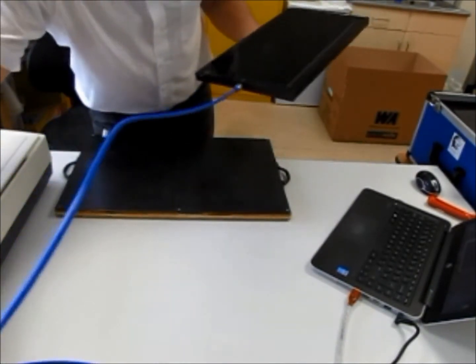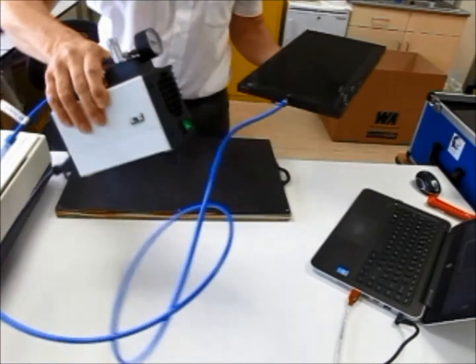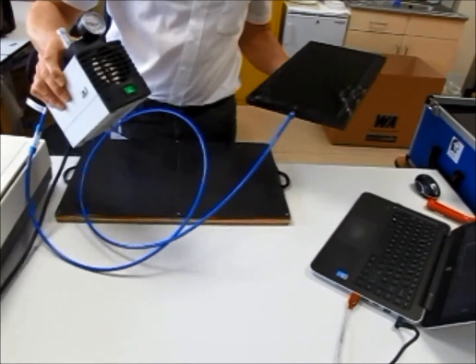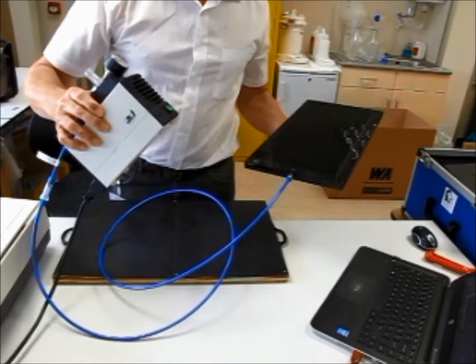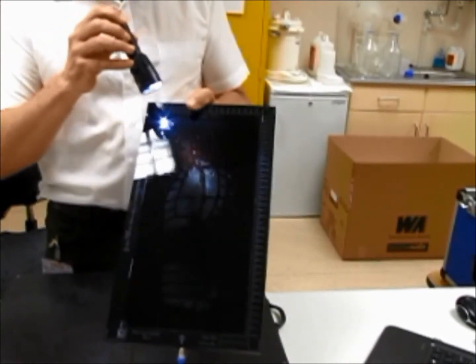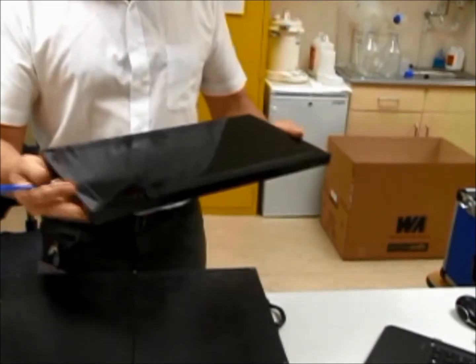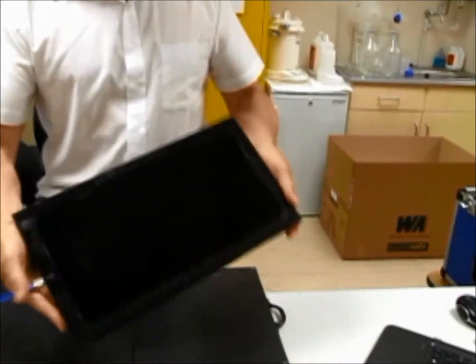We can verify the vacuum is working because we've got a vacuum gauge on there, and it's pulled right round to minus half. That's a good strong vacuum — so firm that we can hold it upside down, and it stays stuck.